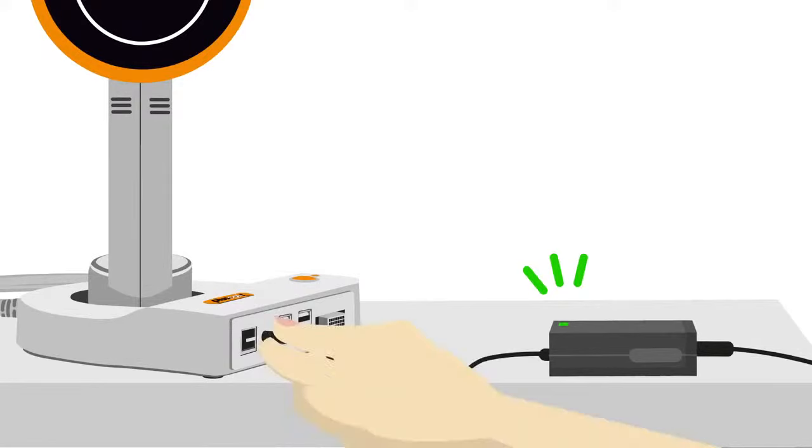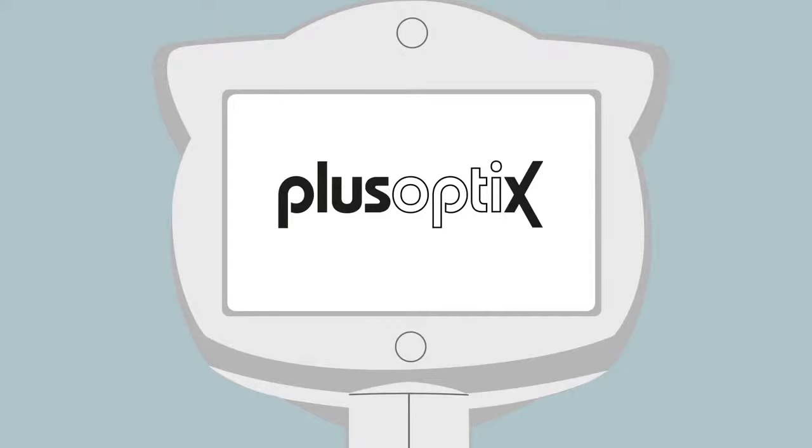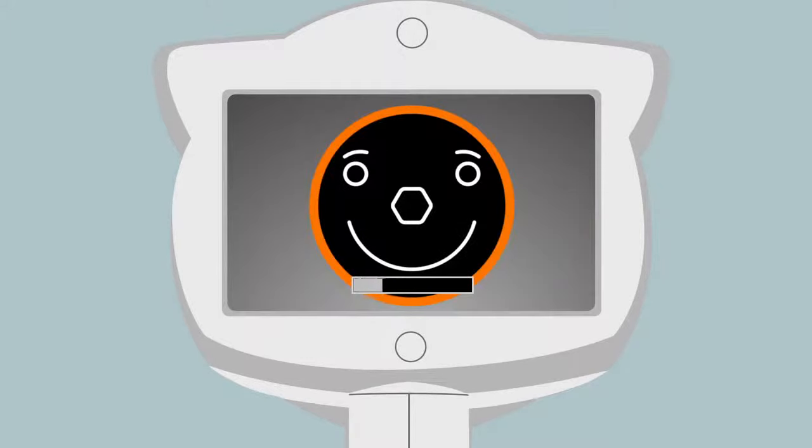Plug the power supply into the device 12V power supply connector. Press the power button and release. It will take about 30 seconds for the PlusOptics device to boot completely. It is normal for the screen to go blank during the boot process.